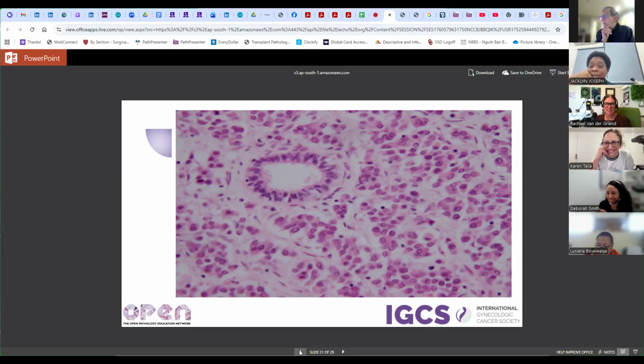If this is a yolk sac tumor, it'd have to be the hepatoid variant because it's so solid and eosinophilic. But usually in that entity, you've got more classical yolk sac morphology, and the hepatoid elements are relatively isolated areas in comparison. I like the term decorated donut rather than Schiller-Duval body because I think it's much more descriptive of what you're looking for, and this doesn't make that for me. But I wonder also about a Sertoli-Leydig tumor that's very poorly differentiated. Those can have little heterologous glandular inclusions as well. So I would include that in the differential considerations.